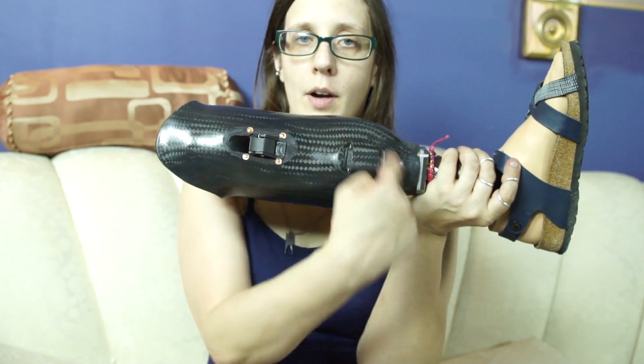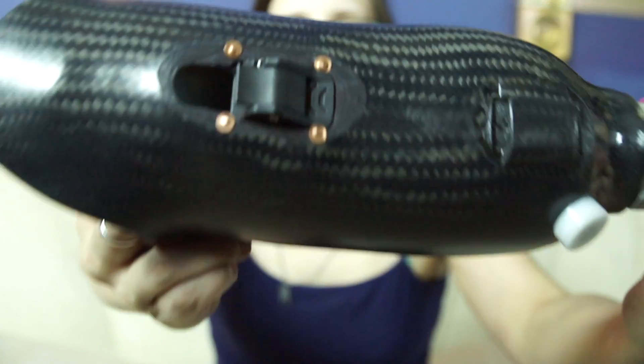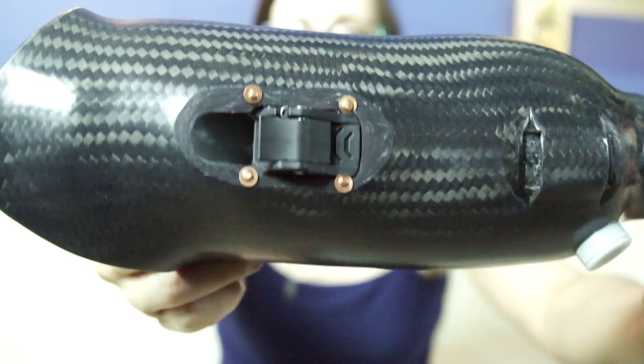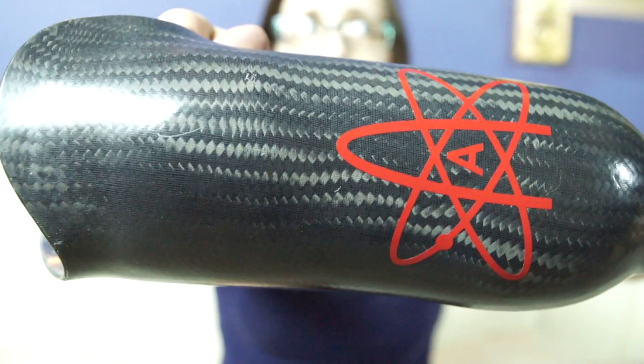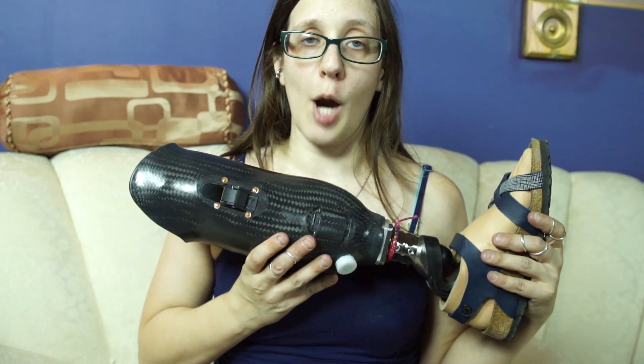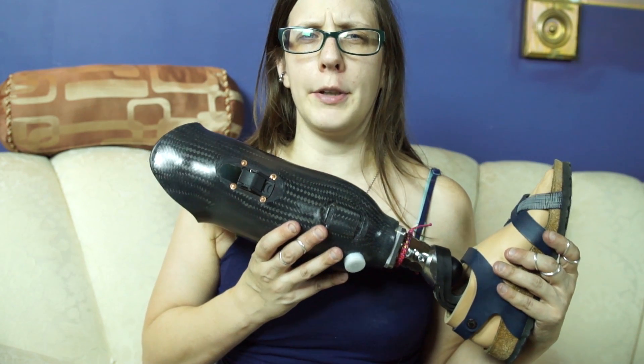The socket of a prosthetic is the part where your residual limb goes into. My socket, and most sockets these days, are made out of carbon fiber. The inside of my leg is made of carbon fiber too, but I had a print laminated on the inside, although you probably can't see it very well. What you'll probably notice on the bottom, instead of the laminated pattern on the inside, are the pads that are in the bottom.